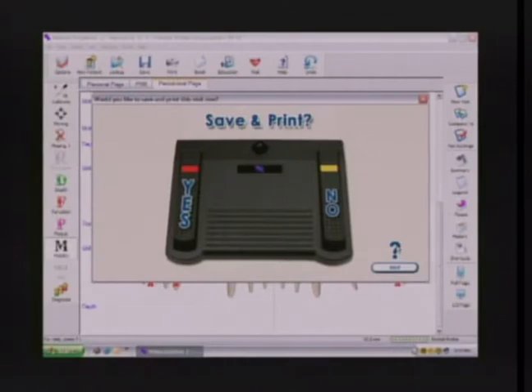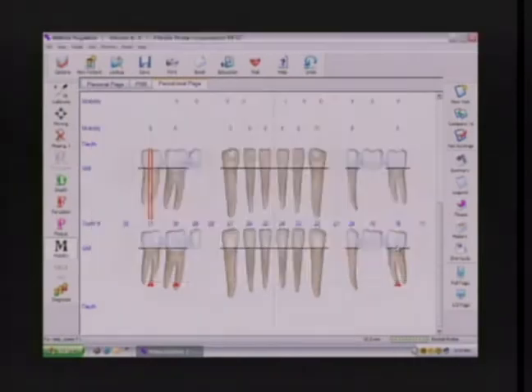And that's part of, remember, some people will actually do this as part of the implementation strategy. They'll turn pocket depth on only, do the pocket depth exam, which includes the dentition, and then when they observe recession, cycle around and turn it on. When they observe furcation involvement, cycle around and turn it on. When they see mobility, cycle around and turn it on. That's another strategy for helping with the time. Okay? So let's say no, we're not done.